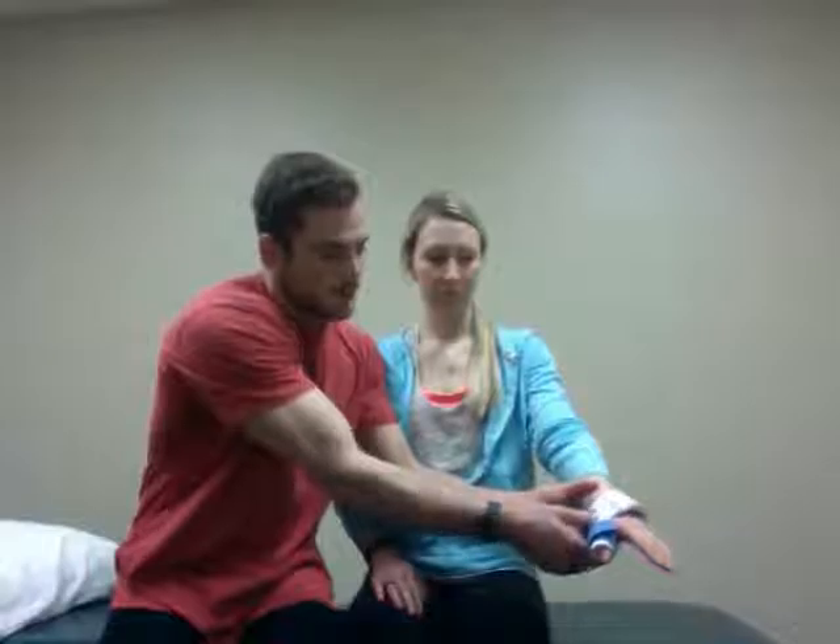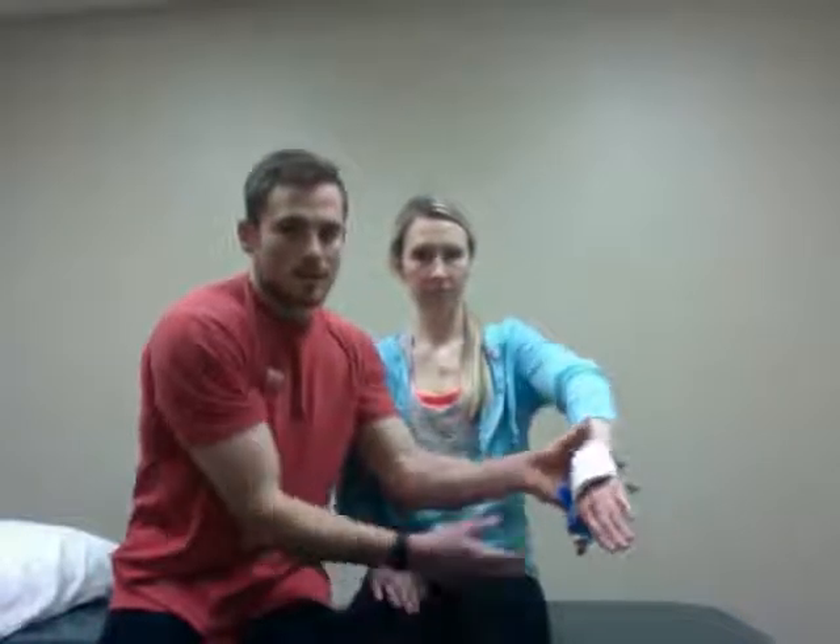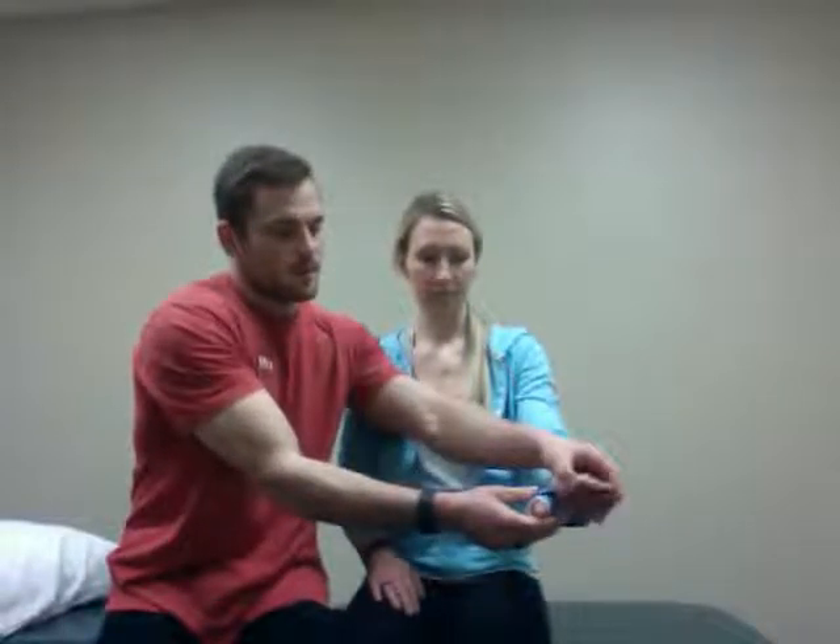I didn't have the correct splint, so we're going to use this thumb spica splint. With de Quervain's tenosynovitis, we're going to be splinting the wrist in about 20 degrees of extension. Ideally I'd want this to cover the wrist completely — it's not, as you can see — but she'd be splinted in about 20 degrees of wrist extension, and the thumb is in the right position here.